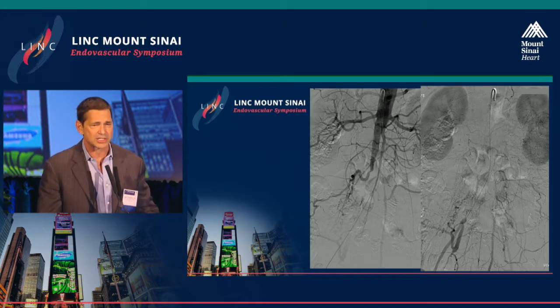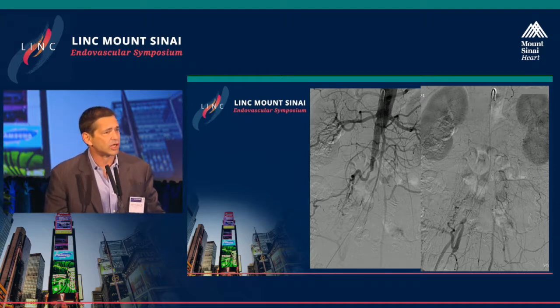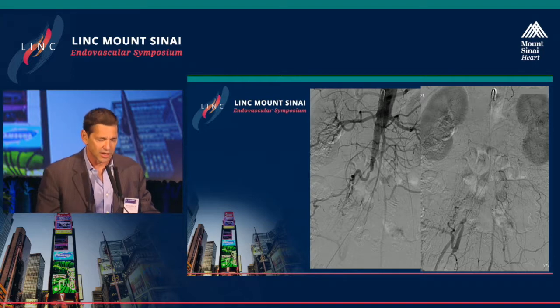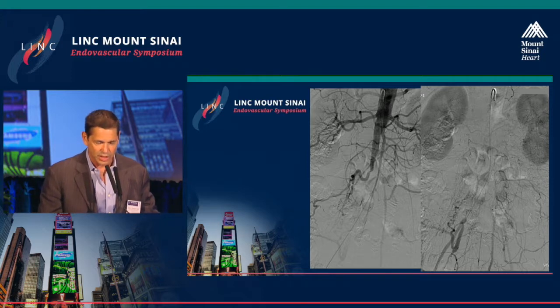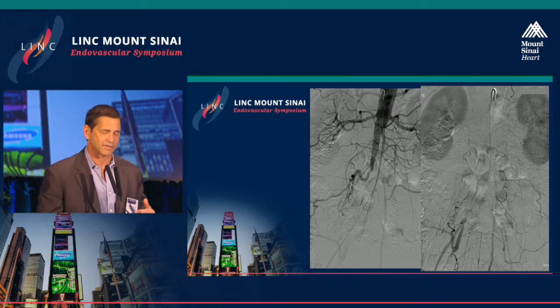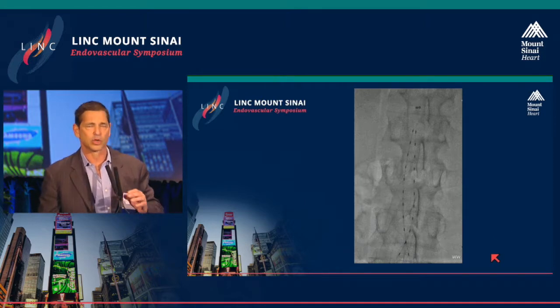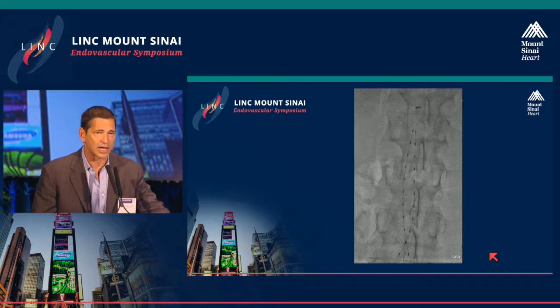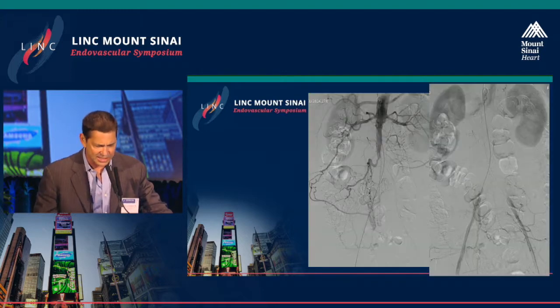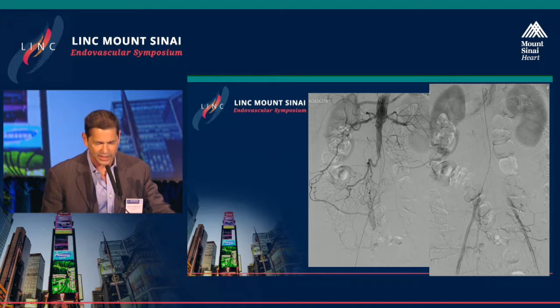This next case was a little more interesting. This patient had acute on chronic presentation — longstanding claudication with sudden aggravation, a wound on his foot, and some ischemic rest pain. Here you can see we've come from a femoral approach and are able to get up through the true lumen or reenter true lumen for this angiogram. The aortic occlusion is at the point of a large outflow vessel — generally infrarenal or through the inferior mesenteric artery, as in this case. You can see reconstituted iliac segments at the hypogastric and iliac bifurcation. Where there might be an element of acuity, we like to give a course of thrombolytic therapy. These are two EKOS catheters parked for overnight infusion. The next day there's not too much change up top, but a little more clarity in the iliac segments.